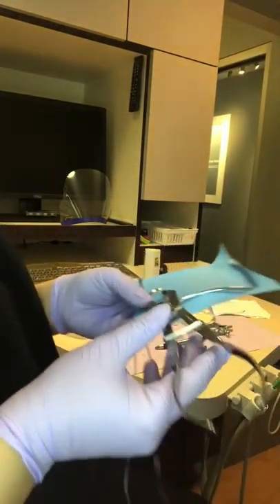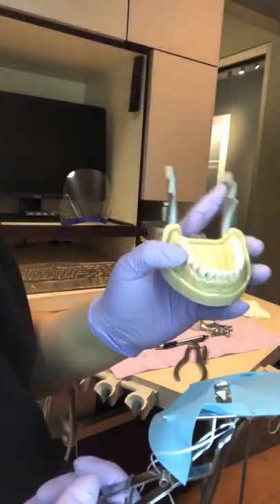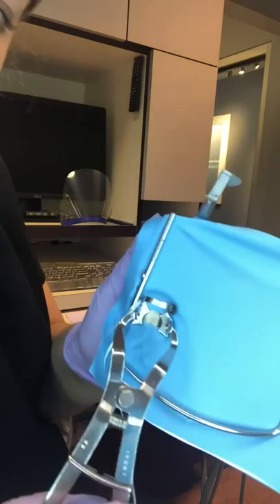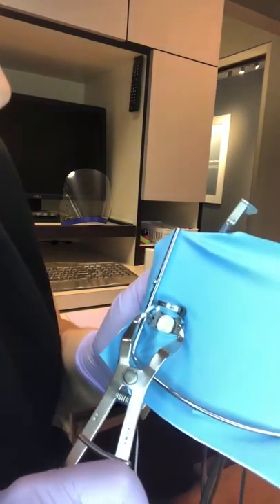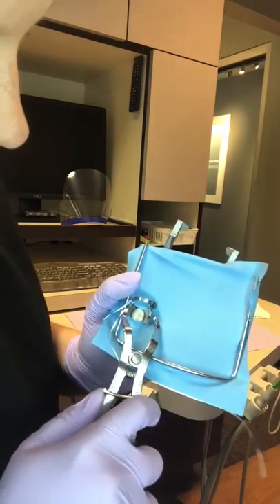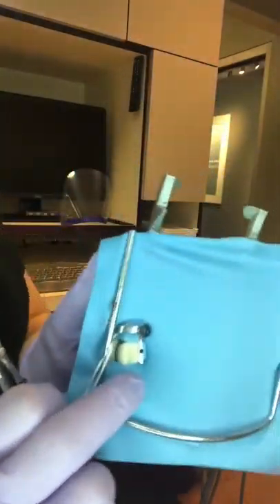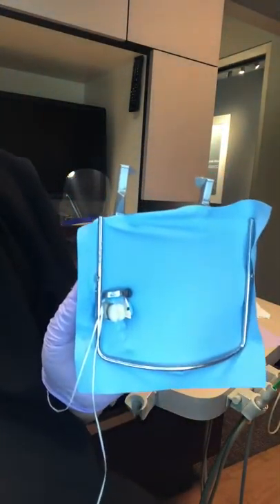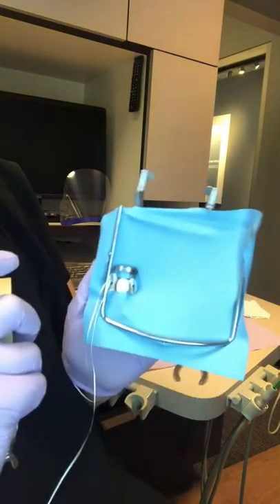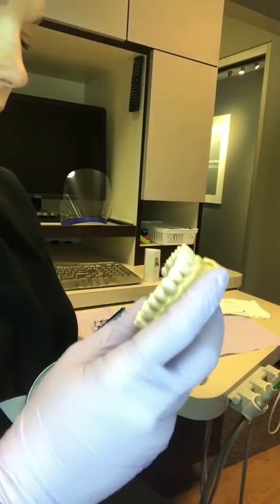We're going to place it on tooth number 30, which is this tooth right here. Rock it from buccal to lingual and release. You have to raise up the locks or it won't release. Now we have our floss coming out and the clamp seated on the tooth. The rubber dam is isolating the entire area — focusing just on this tooth, keeping debris, moisture, and everything out.